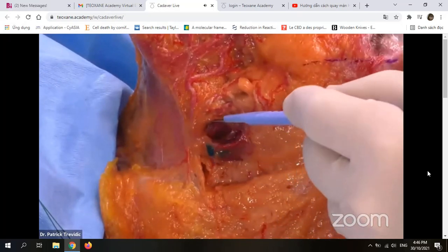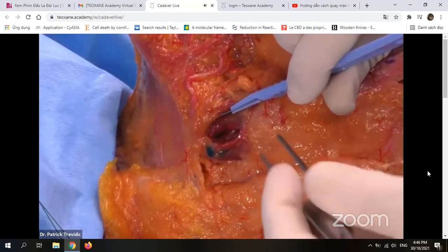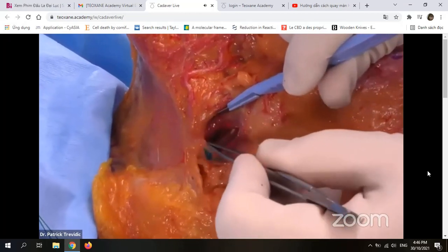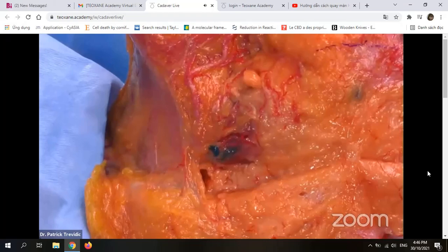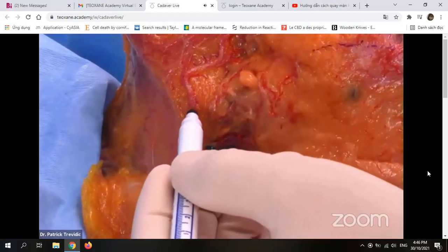So it's a wide muscle, and you see where I injected here. It's on the bone where you see the blue. That is just here. Okay. So this is the deep injection that Nabila did. Just 2 points, what she called the fixed points of the lower face. It's where the facial artery is coming.